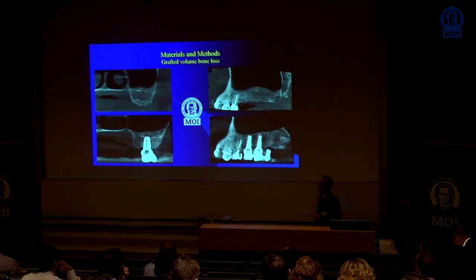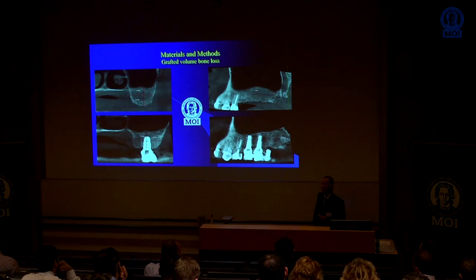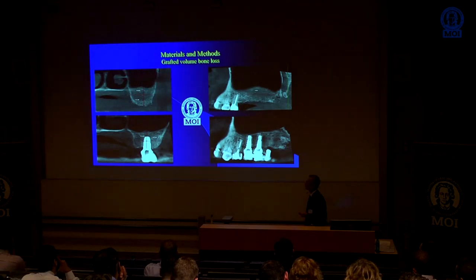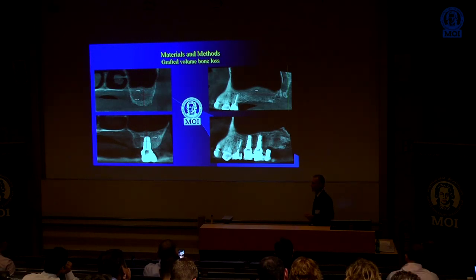The second parameter assessed was the grafted bone volume loss, because we all know that all biomaterials shrink in volume during the healing process and also afterwards during the loading phase when they're used for sinus augmentation procedures. For this specific xenograft, a 30% reduction was established as acceptable. In order to measure it, I took CBCT scan slices in which measurements in the three axes of space were made twice. The first time immediately before implant placement and the second time after the implants had been restored and subjected to occlusal load for 1 year. Later on, the collected data was subjected to statistical analysis to determine its degree of significance.